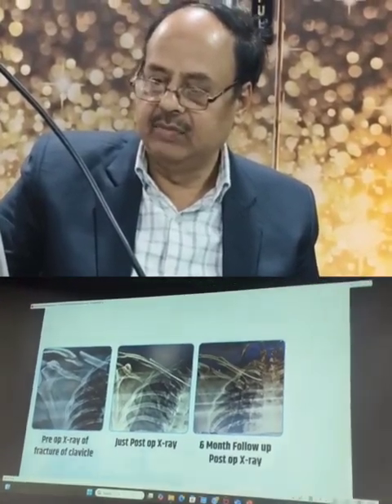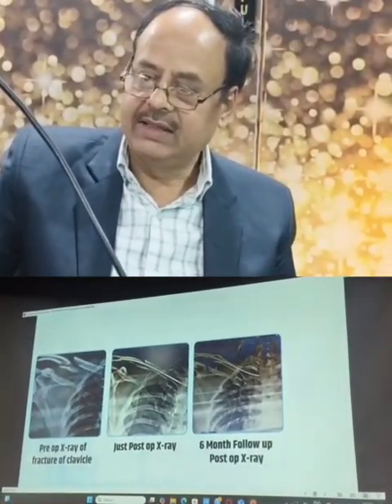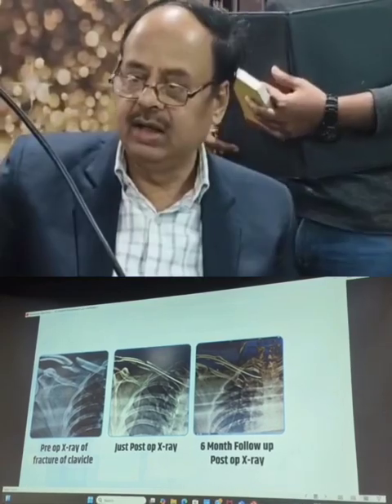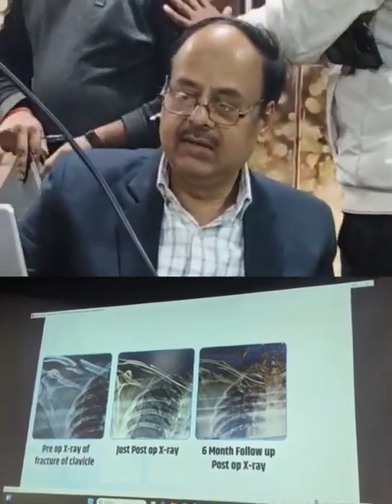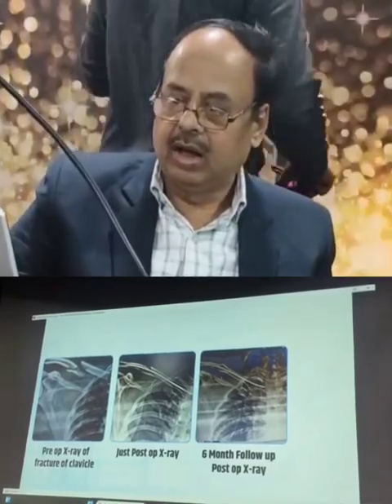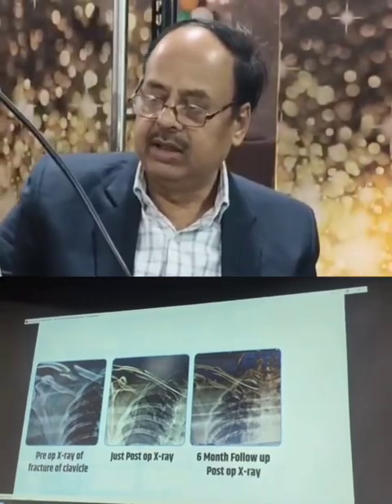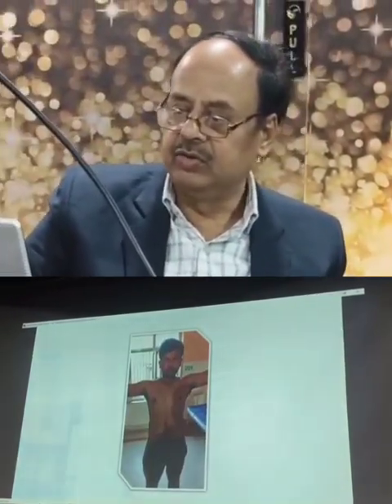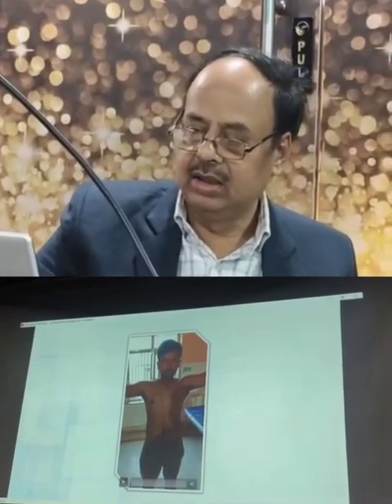Ideally, it should be treated with open reduction and internal fixation with plate and screws. But we did titanium elastic nailing in this case also, and you can see the beautiful union of the fracture at the 6-month follow-up period. So this is the functional result.